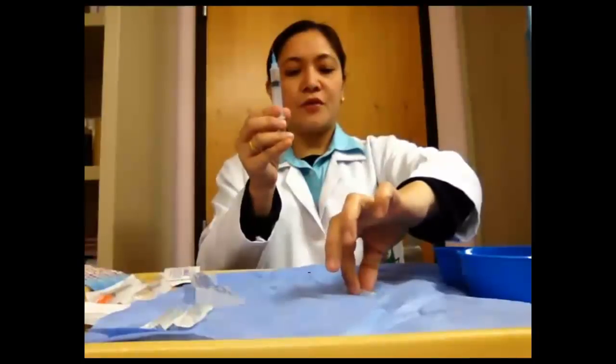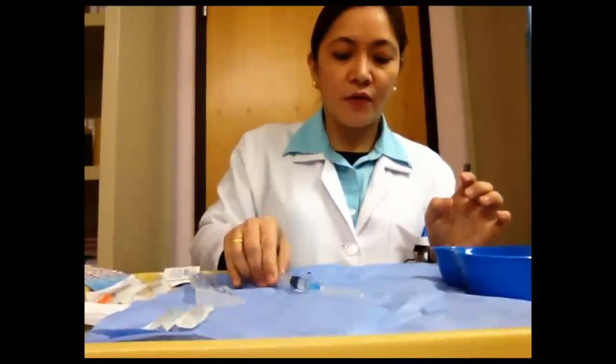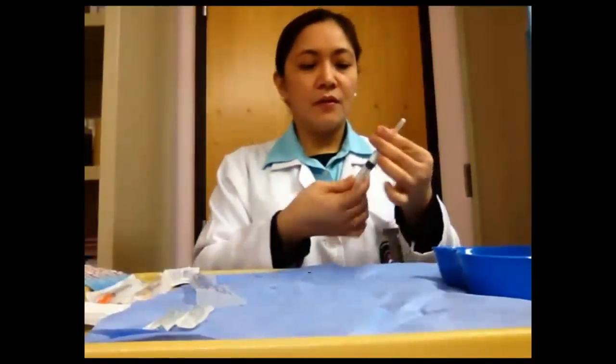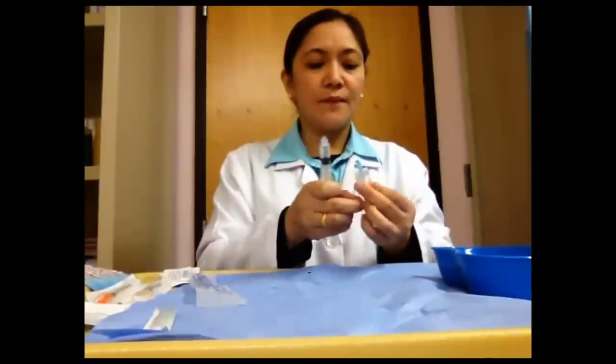Recap the needle using the scoop method. Never hold the cover of the needle. So this is the scoop method. Then remove and change the aspirating needle with a new needle.